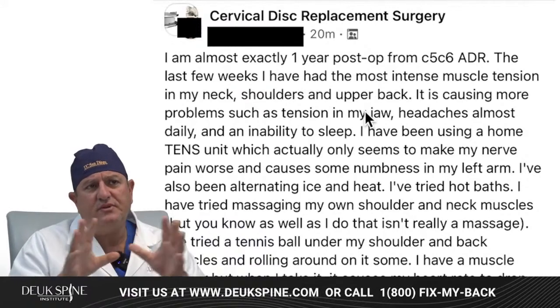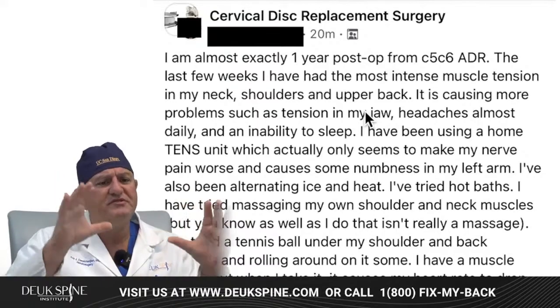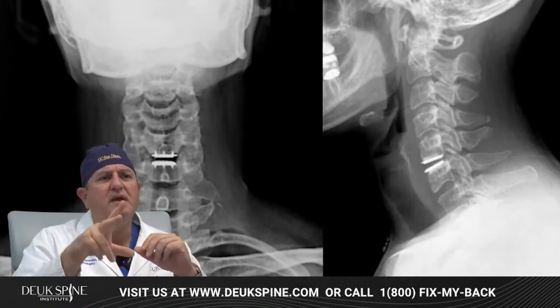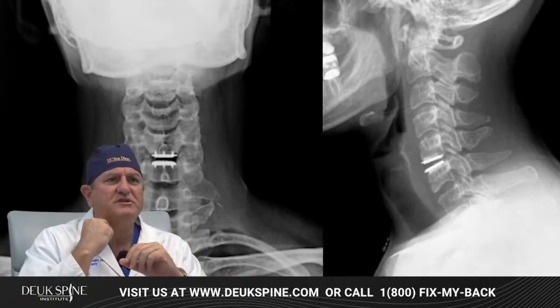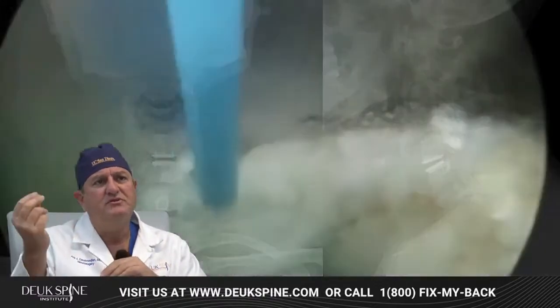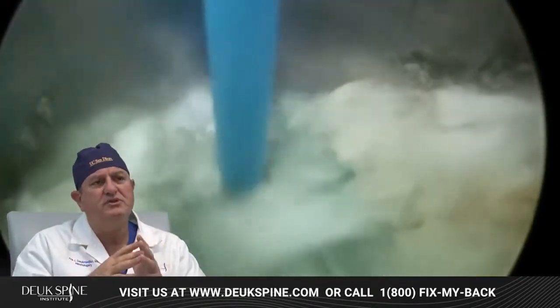They could have had the Deuk laser disc repair, and that's one of the reasons we want to bring this to your attention. You have all this financial pressure from companies that want to put those discs in you so they can make money, and that's driving surgeons to implant these artificial discs that don't work well at all. While on the other hand, there's a new technology using endoscopic surgery, a tiny 4mm incision.